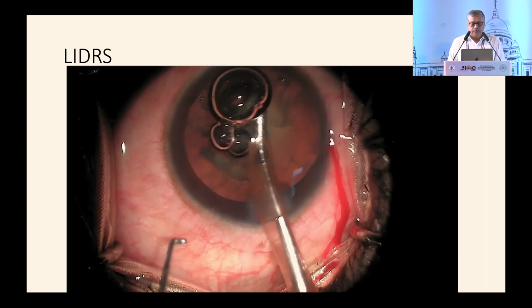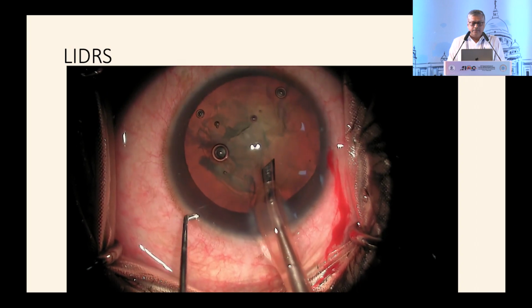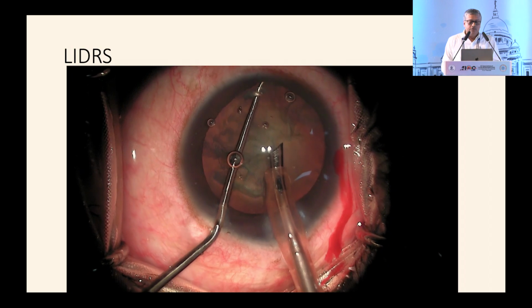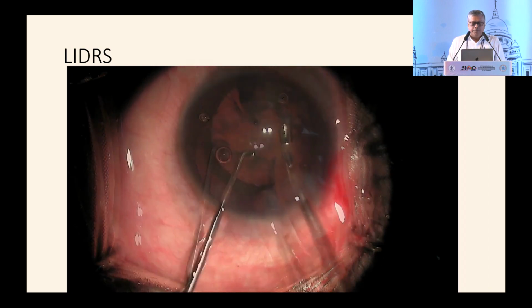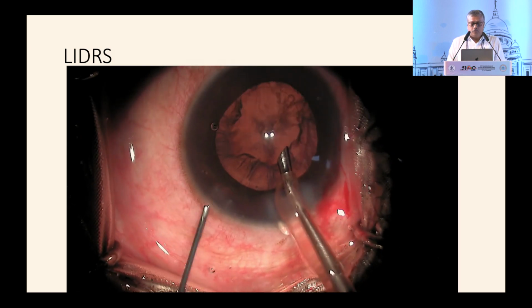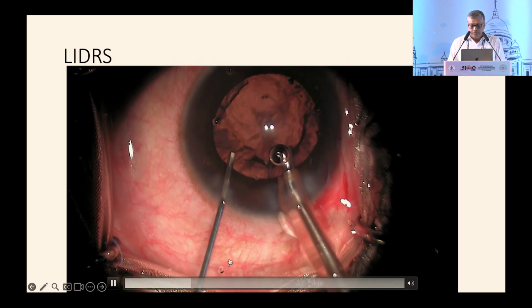You can see that the anterior chamber deepens, and it deepens to such an extent that the iris periphery almost becomes invisible. You use a second instrument to equalize the pressure between the posterior chamber and the anterior chamber, and the whole thing again becomes normalized. So again you need to put viscoelastic while coming out, and that's very important.